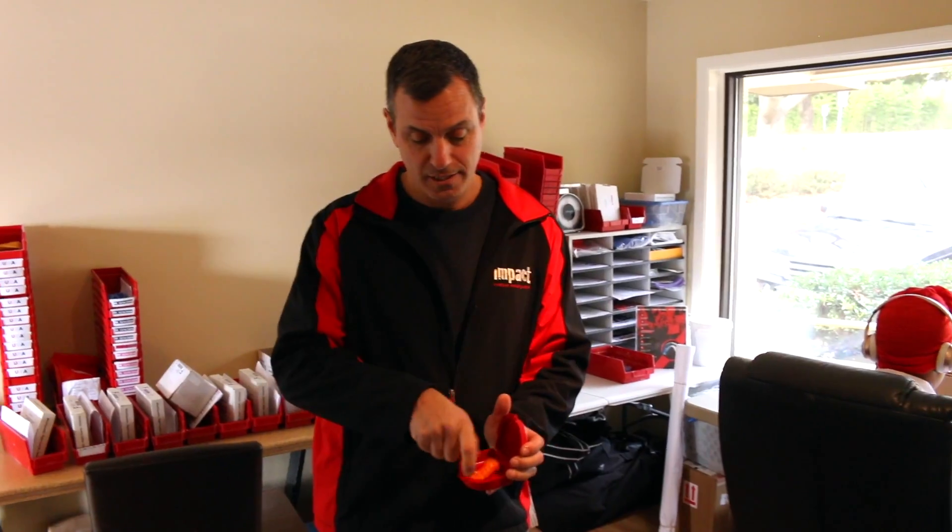Once we've got your guard all trimmed down and cleaned, we bring it right back where we started — to shipping — put it in a nice sturdy case for you, package it up, and ship it to your house. Pop it in, let us know you've received a perfect guard — we'd love to hear from you. And if you're ever in town here in Alpharetta, Georgia, stop by our office and get the tour yourself. We'd love to see you.